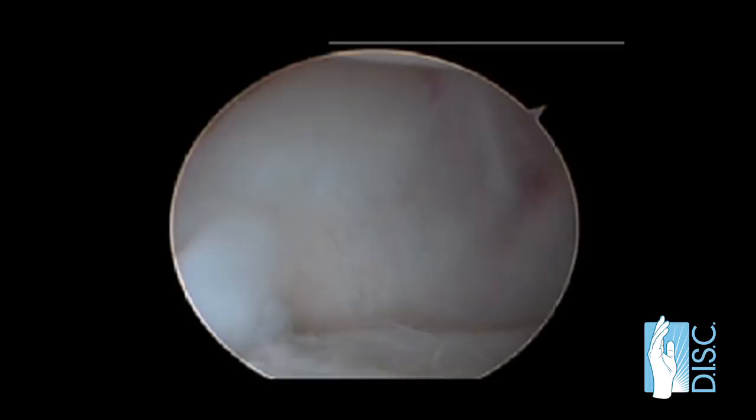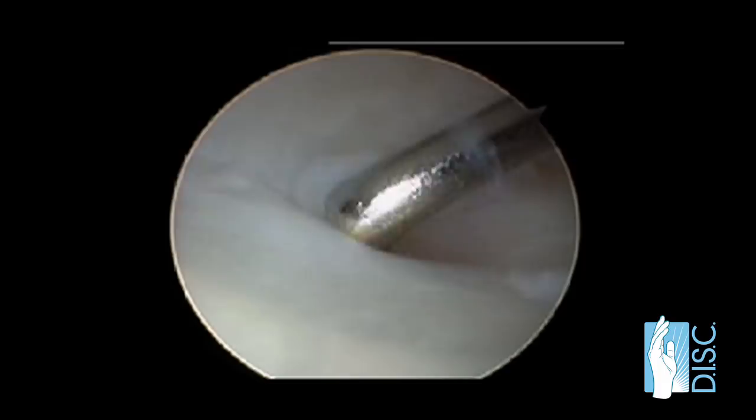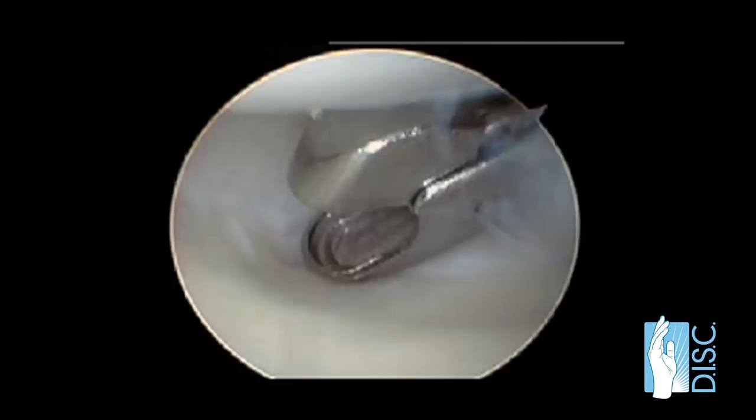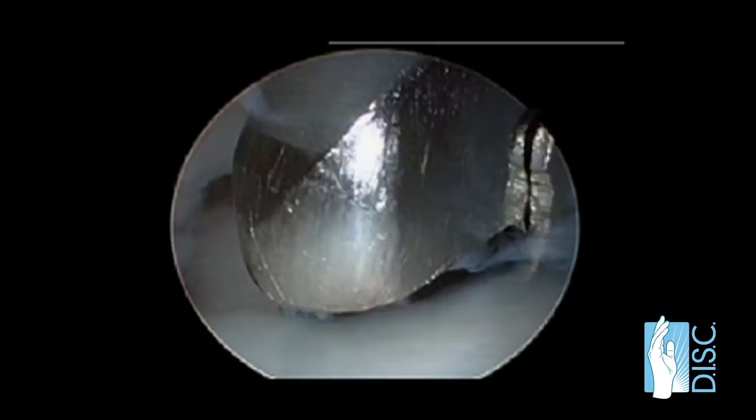We run fluid through the wrist during the procedure that distends the joint, and it's a physiologic salt water, normal saline solution, that allows for optimal visualization. Now finally putting in a little biting forceps that allows me to trim the most radial part of the tear that's up against the radius. It's a very sharp device that actually has suction attached to it.